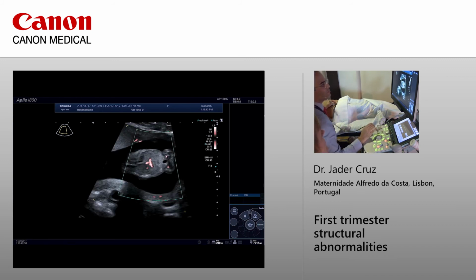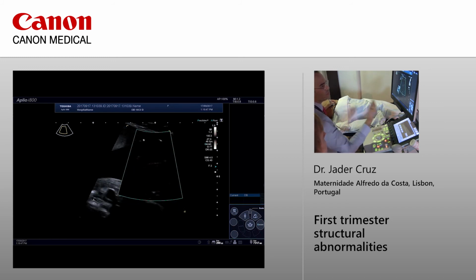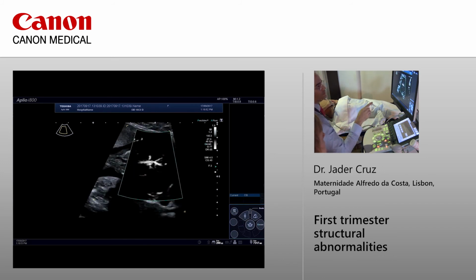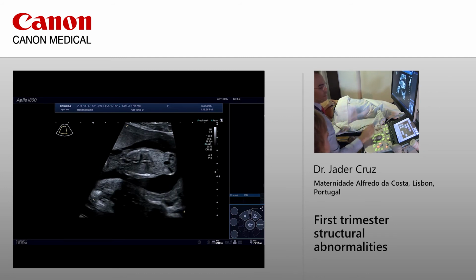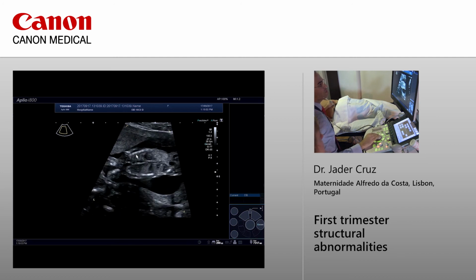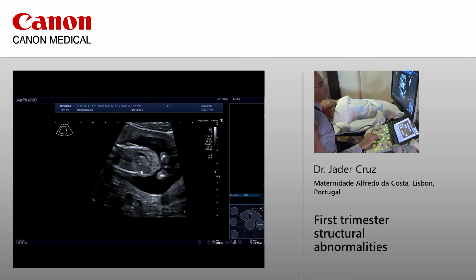But yeah, there's some. I mean, if you want to show together the structure is nice. The thing I like in the SMI is actually the subtraction mode. For the heart, this is the old SMI. Is that right? Yeah, this is the old SMI. You see the difference in the quality of images. The new one is really nice. You can see there the diaphragm. You can see the lungs, bowel, liver.